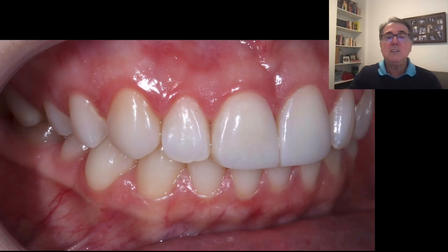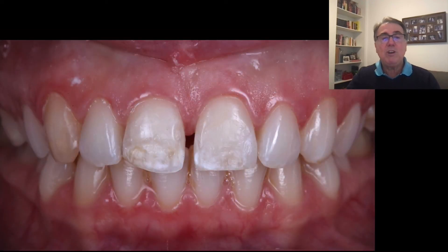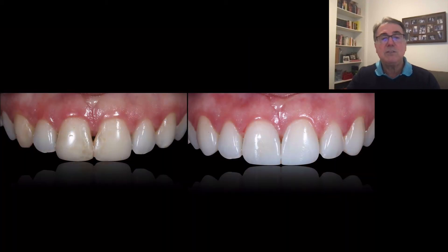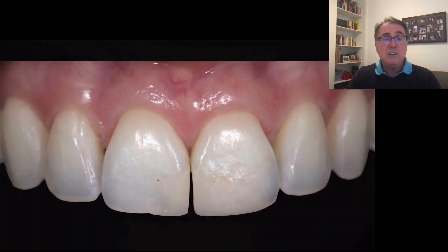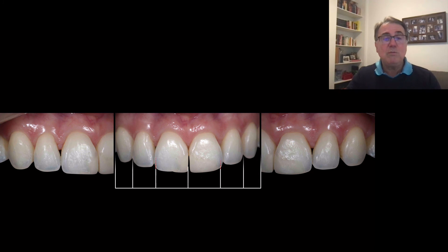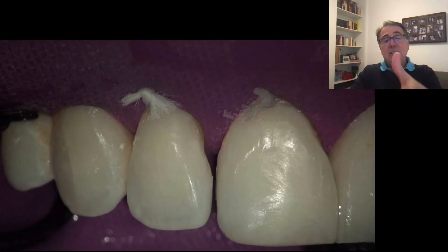Here is the before and after from the side view — before, after removing the old restoration, and after. As I said before, there are other ways to do this. For example, in this case, I had to remove a little bit of the distal of the two centrals to get them into proportion, because the patient thought those centrals were too wide. So I had to remove a little bit, and then it created a very small diastema. In that case, you can use the BioClear Matrix, which is a very good solution for situations like this.